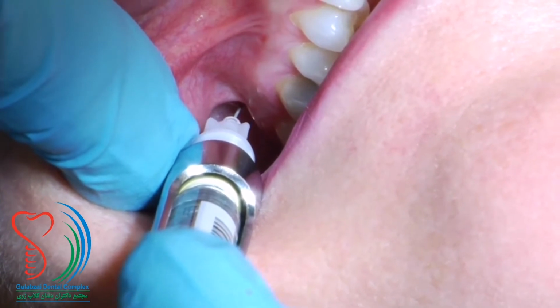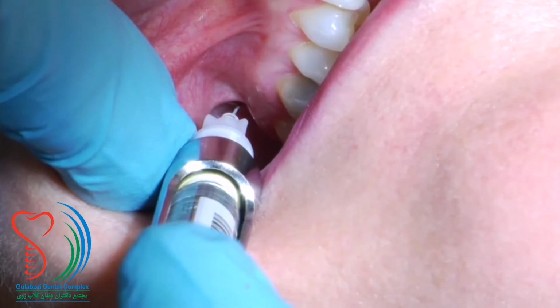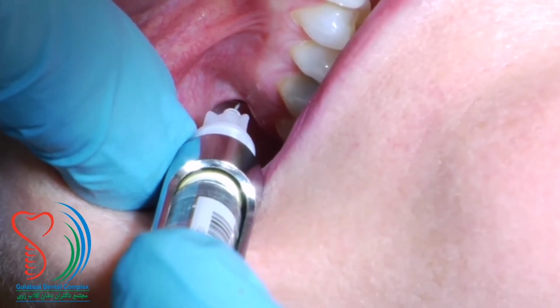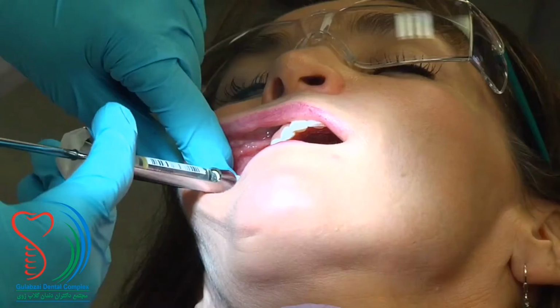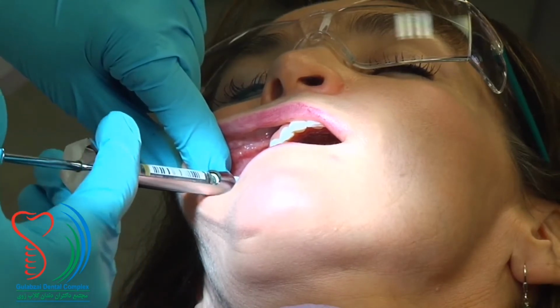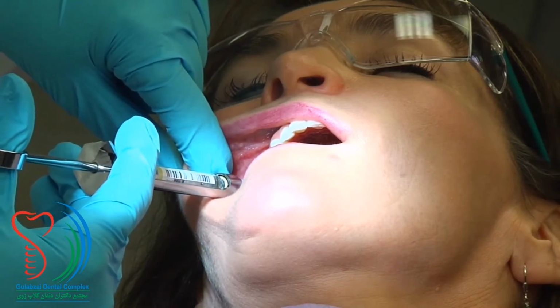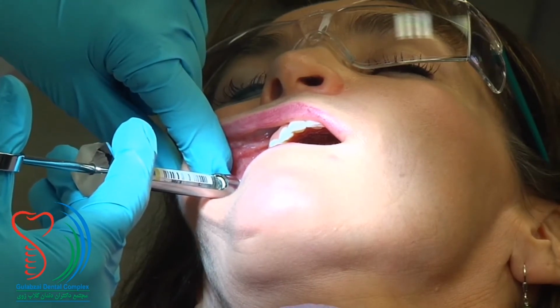About 3/4 of an inch is the depth of this injection. Once you're there, obtain a negative aspiration in 2 planes and then start depositing the anesthetic. 1/2 to 3/4 of a carpule will be necessary with multiple aspirations.